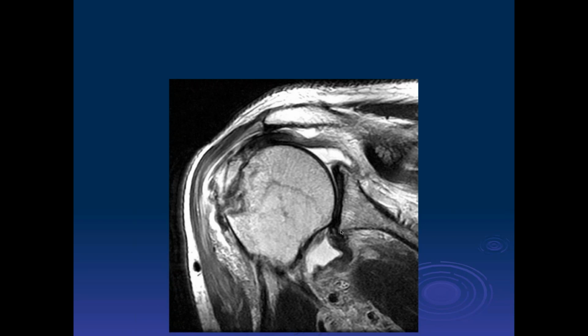Okay, again, we have a tear of the inferior capsule. I see the glenoid attachment, but again, I think it's probably mid-substance, or humeral, two humeral attachment. Very good. My guess is that this tissue probably fits up here, and so this would be more humeral in this case. And then we can see there's a tear of the rotator cuff as well.